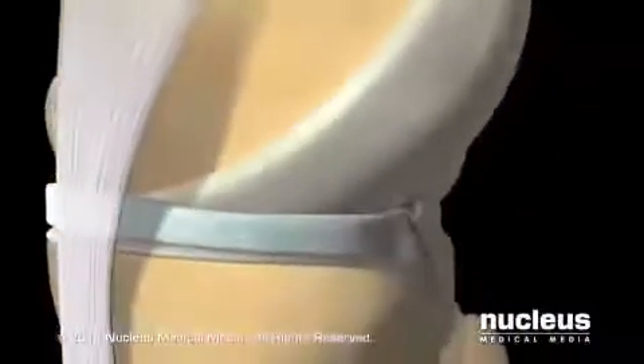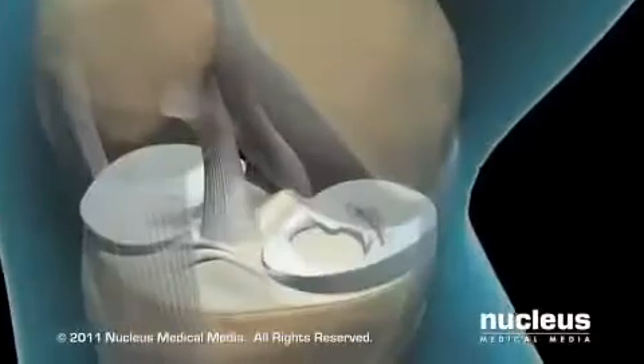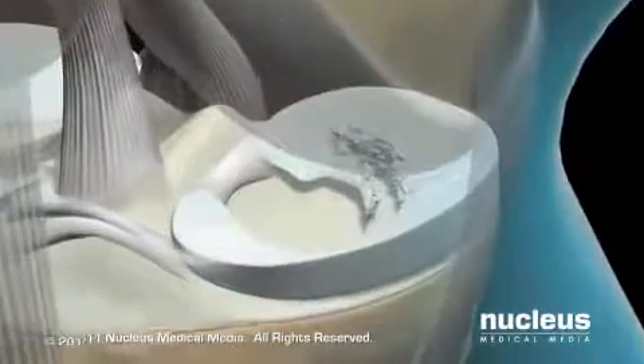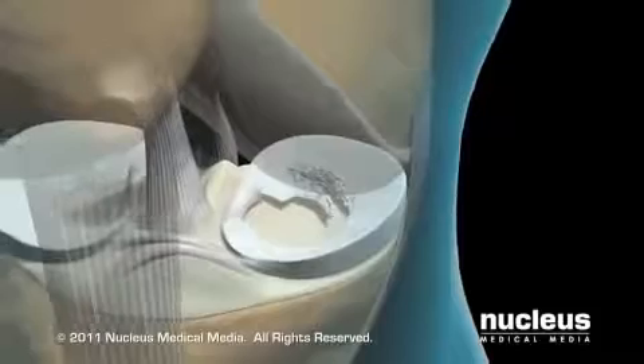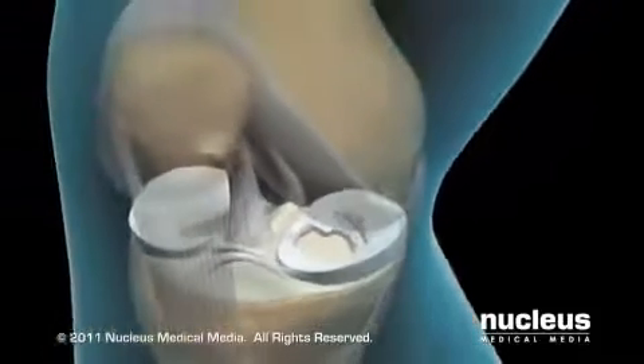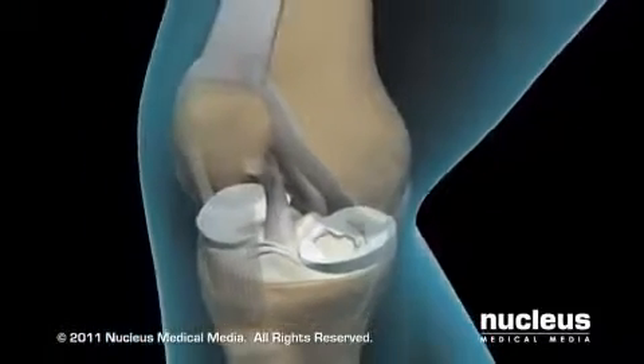Under normal conditions, the menisci — C-shaped pieces of cartilage resting between the femur and the tibia — provide cushioning and stability for your knee joint. Injuries or arthritis can cause the menisci to become torn, resulting in knee pain, swelling, and diminished range of motion. Knee arthroscopy is often performed to remove the damaged portion of the meniscus.